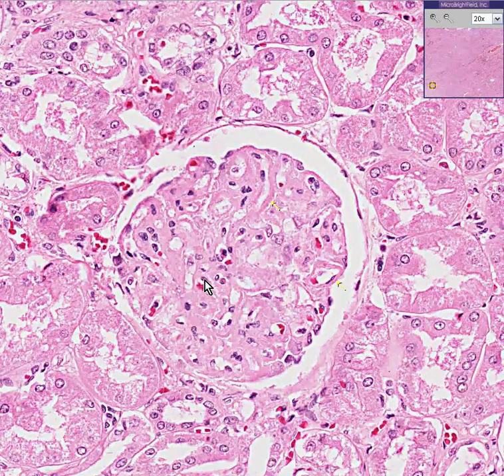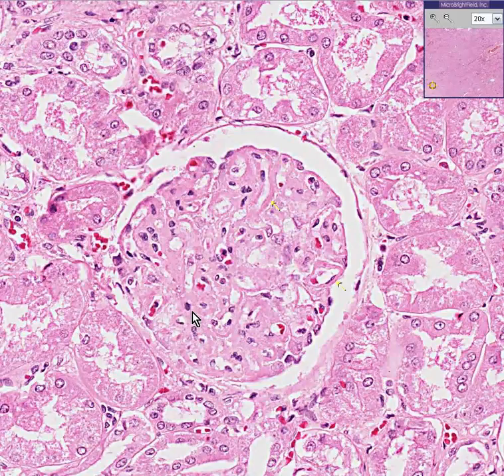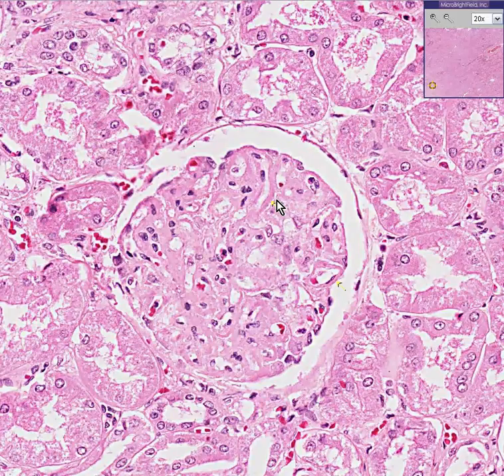Here's a capillary, and everywhere you see a blood cell, there's a capillary. The spaces between these capillaries are generally diffusely thickened. These are due to immune deposits within the glomerular basement membrane.